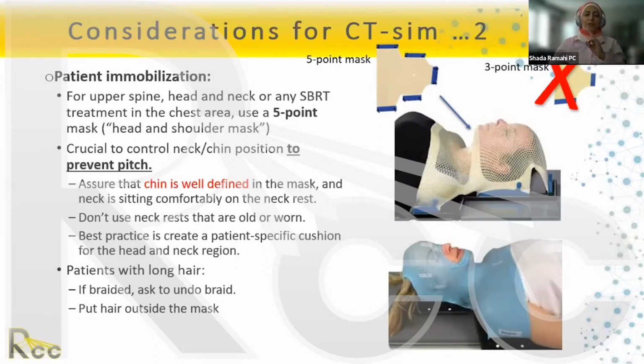I want you to notice something. Notice how the chin has a more rigid structure here, while the face has a looser structure. Notice the mask around the face is light, whereas we have a more rigid structure under the chin. The chin is important. Same thing in this image: see how the chin is kind of double-bagged or double-lined.